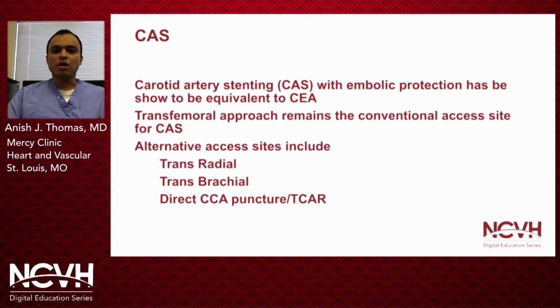Carotid artery stenting with embolic protection has been shown to be equivalent to carotid endarterectomy. While the transfemoral approach remains the conventional access site for carotid artery stenting, alternate access sites include transradial, transbrachial, and more recently, TCAR. However, even direct carotid puncture has been performed.